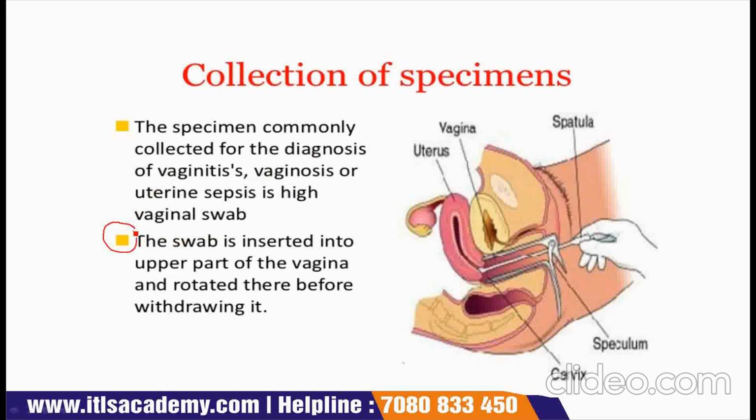Next point is, the swab is inserted into the upper part of the vagina and rotated there before withdrawing it.